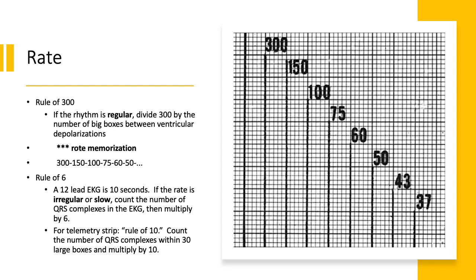I don't frequently have the need to do that because telemetry, for the most part, is computerized now, so you don't really need to print out strips to determine heart rate. But if you ever need to do that in a pinch, now you know how to do it.